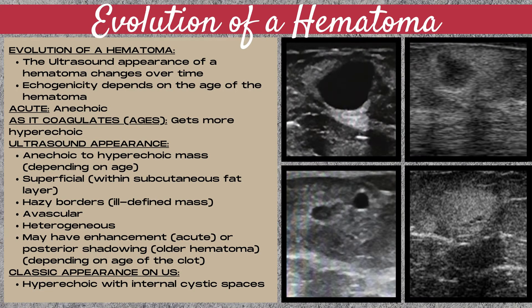It's going to be superficial within the subcutaneous fat layer. Note that a hematoma is not a skin mass. It is going to have very hazy, ill-defined borders. It's going to be avascular and heterogeneous. It may have enhancement if it's in the acute anechoic phase, or it may have posterior shadowing if it's in an older stage where it's become more hyperechoic.